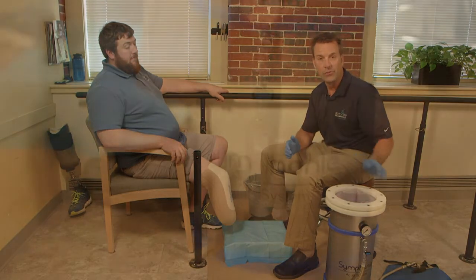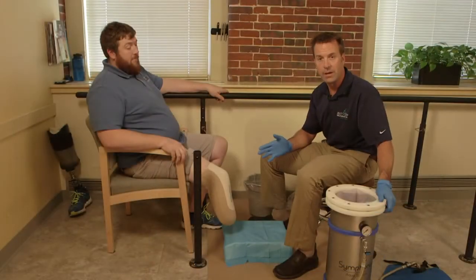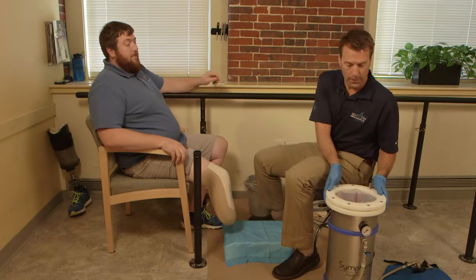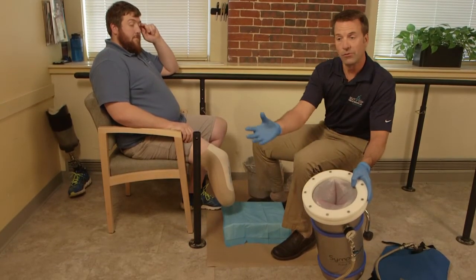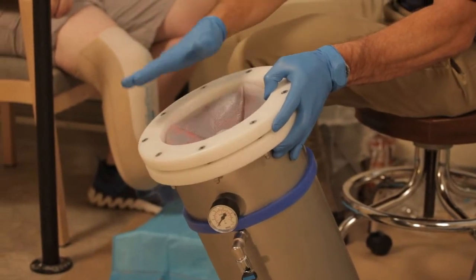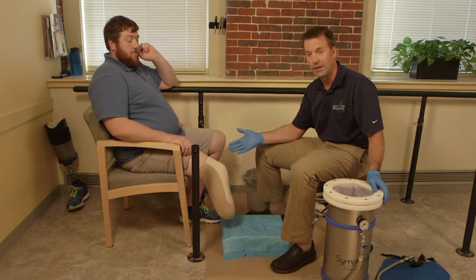Today we're going to be going over the Symphony AquaCast below the knee casting system. It is a unique system that allows us to cast a patient and create a cast under total weight bearing. What makes this unique is the bladder inside of the cylinder that is surrounded by water. Once we have wrapped the limb, we will have the patient stand up and put their limb into the casting vessel under full weight bearing. After all, we are designing the prosthesis to stand and walk on, not to be sitting in a chair.